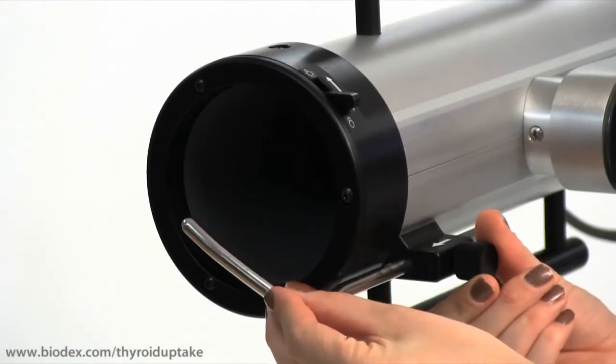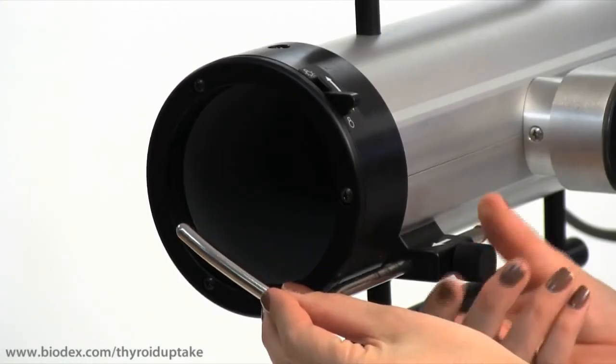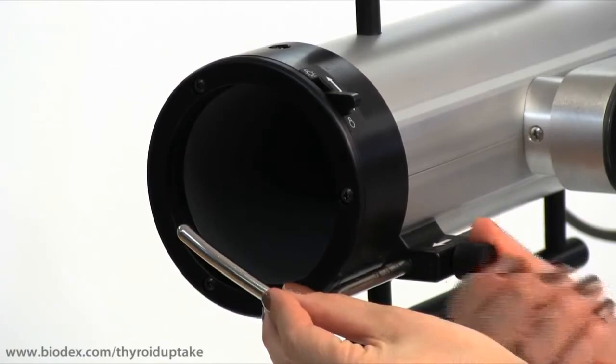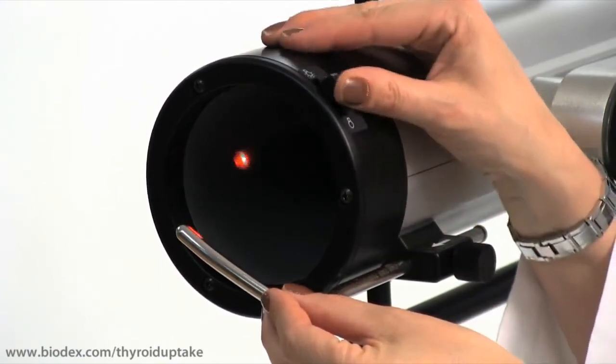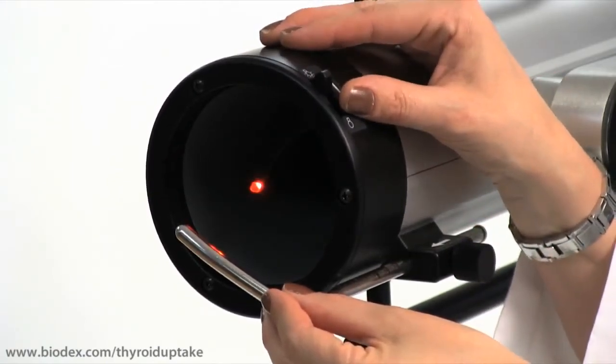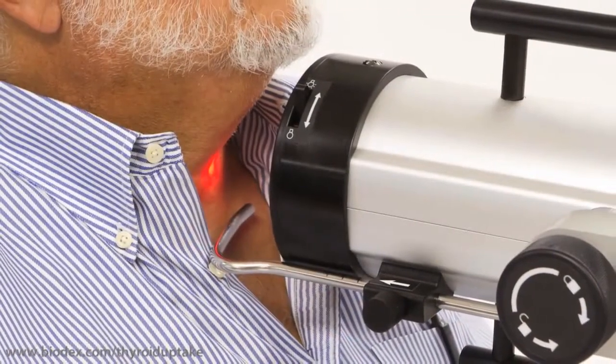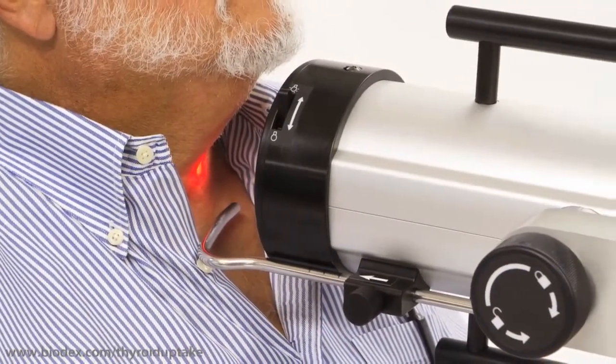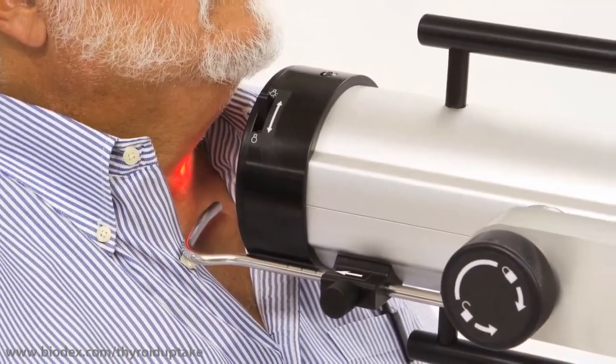The combination of the new positioning LED, a first in the industry, with a convenient calibrated distance measurement rod, makes the AtomLab 960 ideal for easy, reproducible patient positioning and accurate test results.